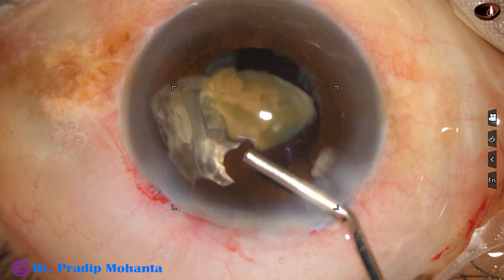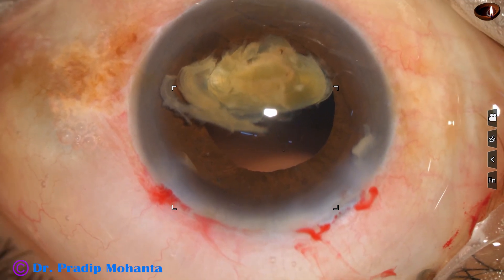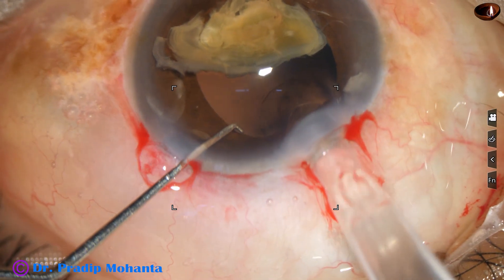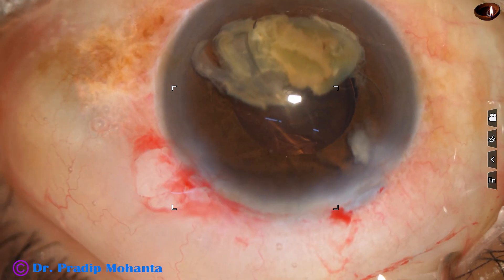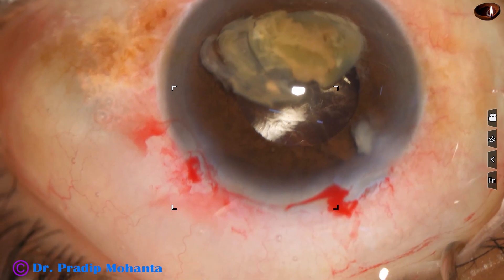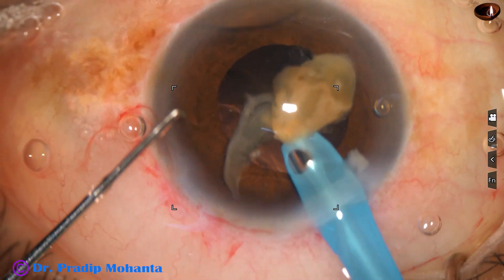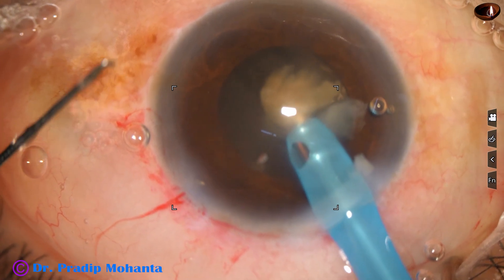Inject visco. As I inject visco, the piece goes towards six o'clock. Visco should be injected both above and below the piece so that the nuclear piece doesn't touch the corneal endothelium. I have enlarged the main wound a bit, and here goes an intraocular lens into the capsular bag. Once the lens is in the bag, we can safely emulsify this nucleus. The handpiece goes again and emulsifies this last portion of the nucleus, and the intraocular lens protects the posterior capsule.